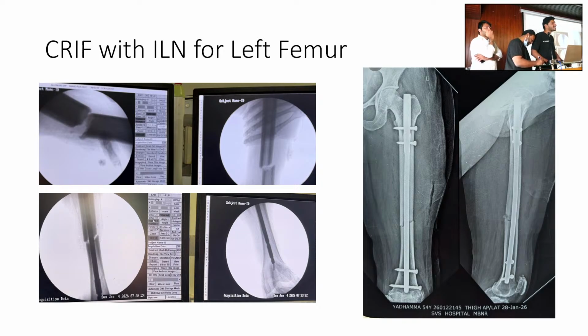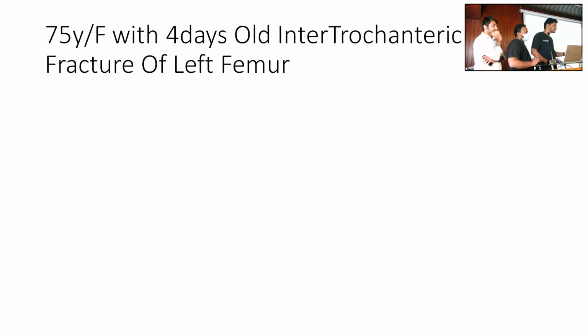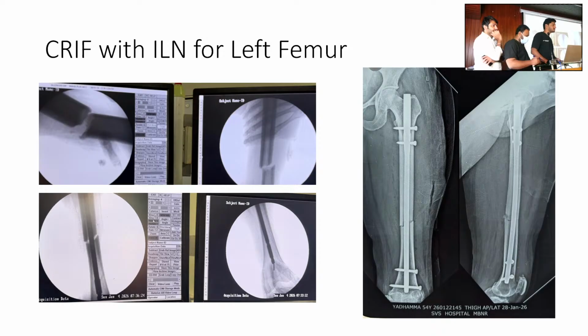It is not an extractor or an impactor. It is called a slotted hammer. You have to take it and try to pull the nail out.